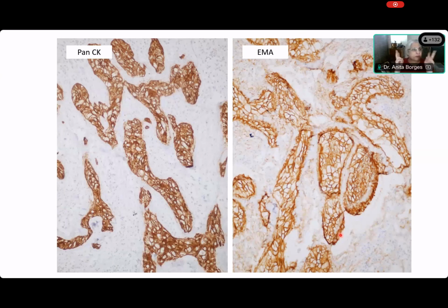Just two simple immunostains, pan-CK and EMA. Now, come on, Somik. Priyadarshini said no, that this is not myoepithelial. What do you think, Somik? I'm not sure. You can make out straight away simply on these two stains. Come on. Akshara, you want to help him?